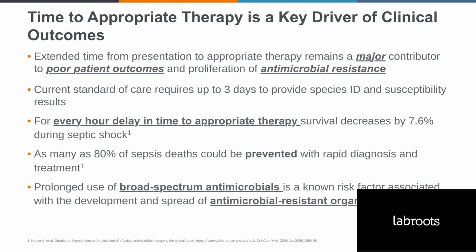The time to appropriate therapy is a key driver of clinical outcomes, and the extended time from presentation to appropriate therapy remains a major contributor to poor patient outcomes and proliferation of antimicrobial resistance. The current standard of care, as we discussed, can take up to 3 days to provide the results, which can delay time-sensitive, life-saving targeted treatment. And prolonged use of broad-spectrum antimicrobials is a key risk factor associated with development and spread of antimicrobial-resistant organisms. Also, we know that rapid diagnosis and treatment could prevent as many as 80% of sepsis deaths.